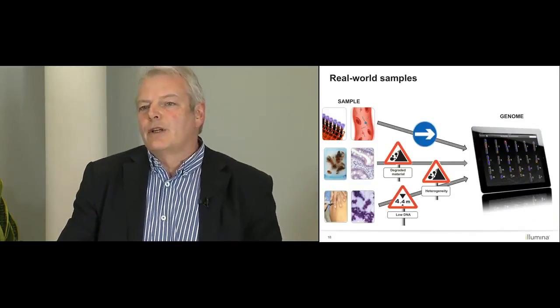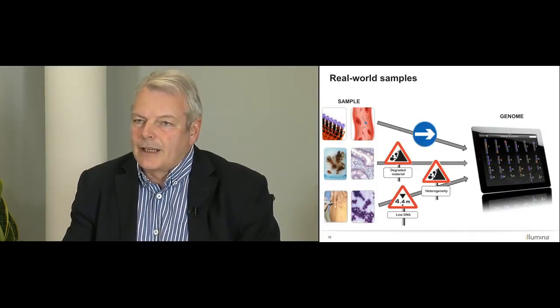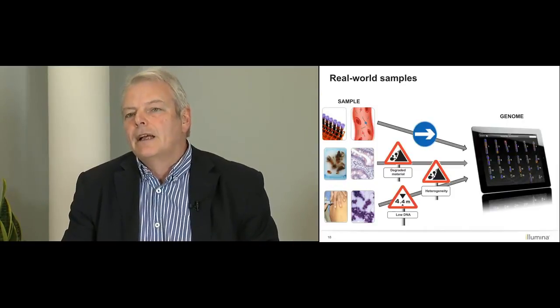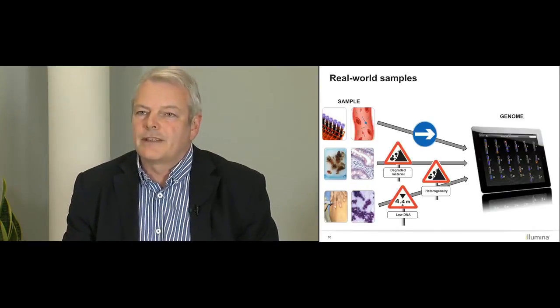One of the challenges in moving from basic research to clinical space, of course, is that we are dealing with real-world samples, and just rather schematically they're illustrated here. Blood samples have really been the bread and butter of a source of DNA for many tests, and of course that is now emulated further with the use of cell-free DNA for precise tests.